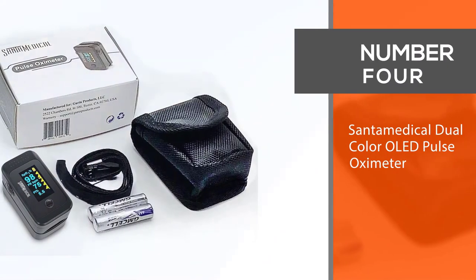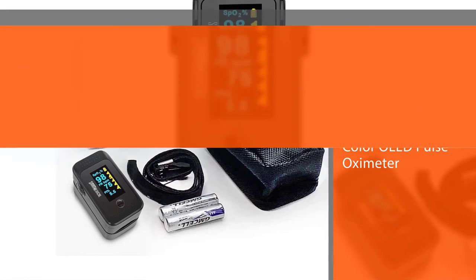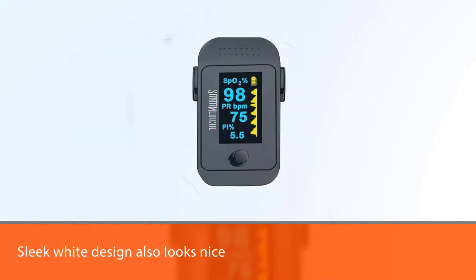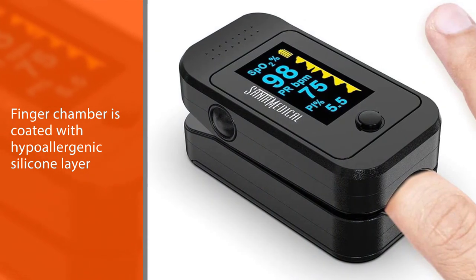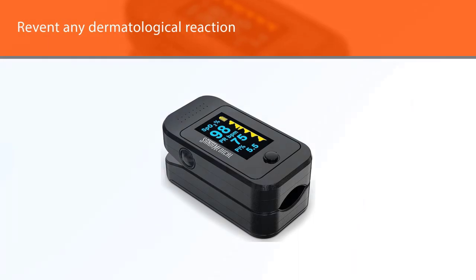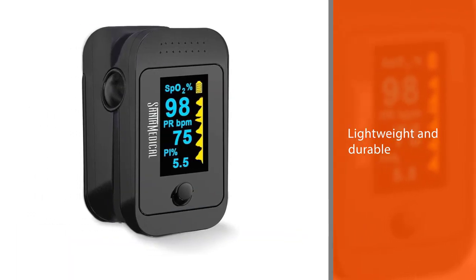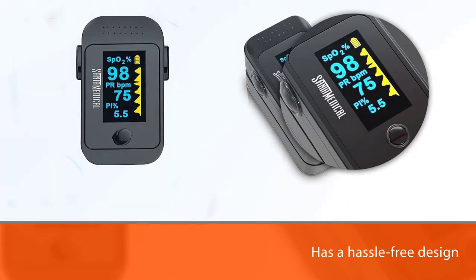Number 4. Santa Medical Dual Color OLED Pulse Oximeter. Not only does it function well, but the sleek white design also looks nice for any medical professional or for someone who wishes to use the device at home. A thoughtful feature is its finger chamber coated with a hypoallergenic silicone layer to prevent any dermatological reaction for those with sensitive skin. It is also lightweight and durable, making it an obvious choice for many nurses and respiratory therapists. It has a hassle-free design and is highly efficient, especially in its power consumption and extended battery life.